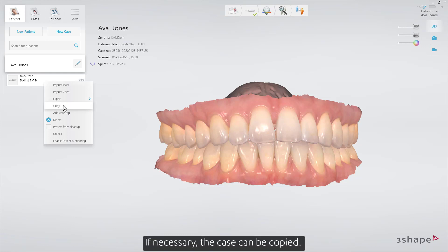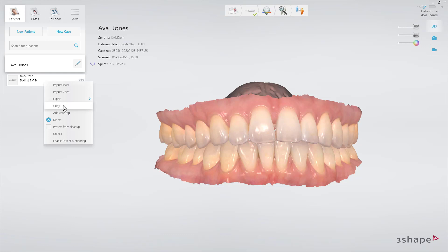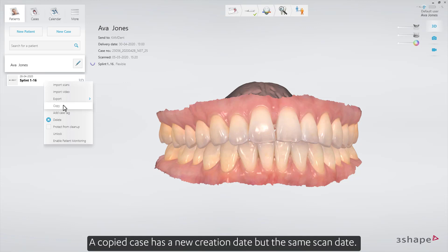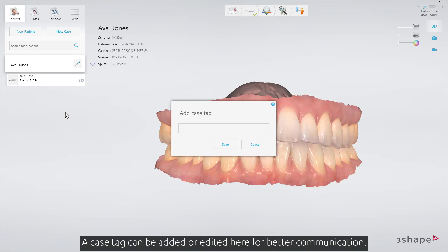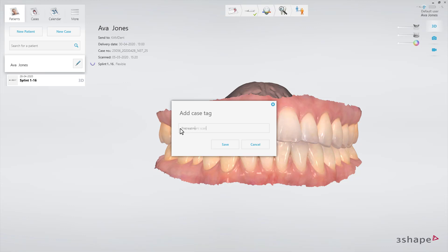If necessary, the case can be copied. A copied case has a new creation date but the same scan date. A case tag can be added or edited here for better communication.